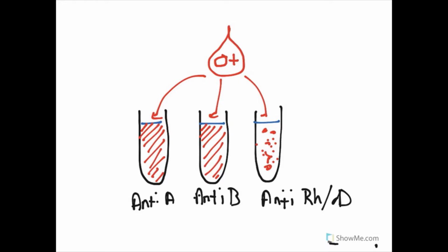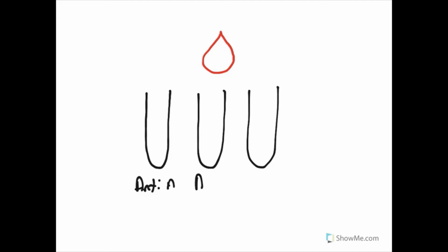Okay? So you might begin to see a pattern here in what I'm doing, and it may become too easy for you on the next ones. But, so again, let's say now I did some changes around. I've got my blood here again. I've got my 3 wonderful test tubes here full of antibodies. Again, anti-A, anti-B, and anti-RH or D antigen. And these vials have those in it.